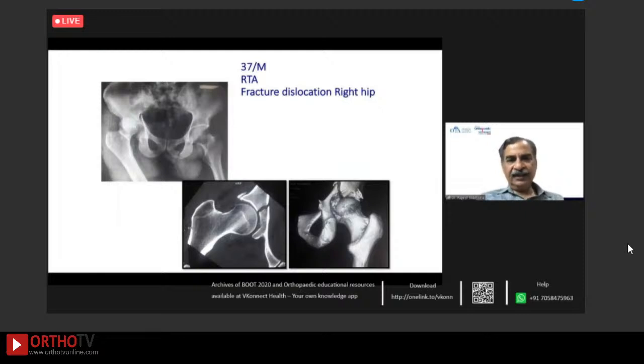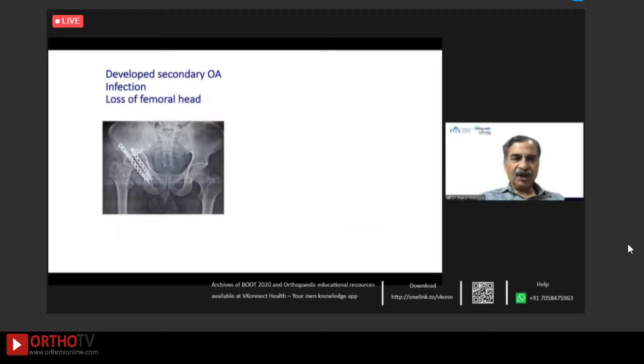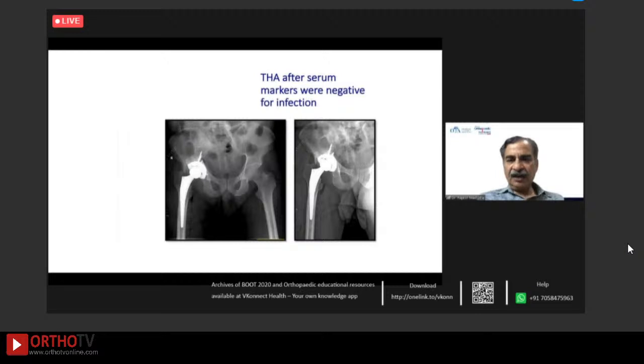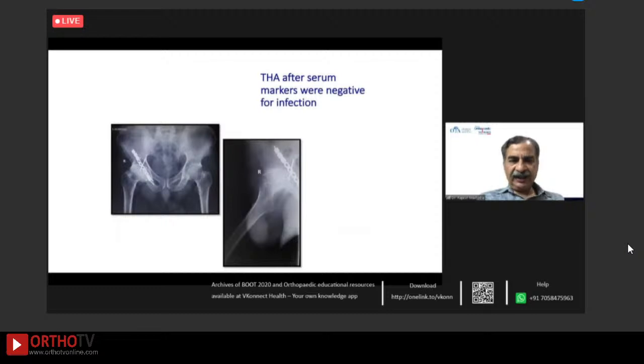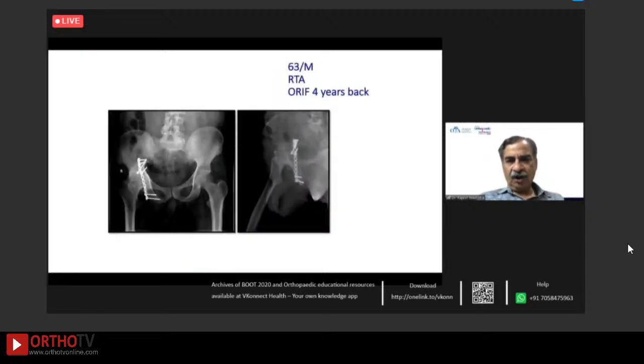Fracture dislocation right hip in a 37-year-old male, and ORIF was done elsewhere, and developed secondary osteoarthritis, infection with the loss of femoral head. So 10 months after the index surgery, the debridement and hardware removal had to be done, and the total hip could be done after the markers were negative. And another case, suggestive of infection control by the markers. And the acetabulum is so supportive that you can actually put it without any screws through the dome, and this is the follow-up.